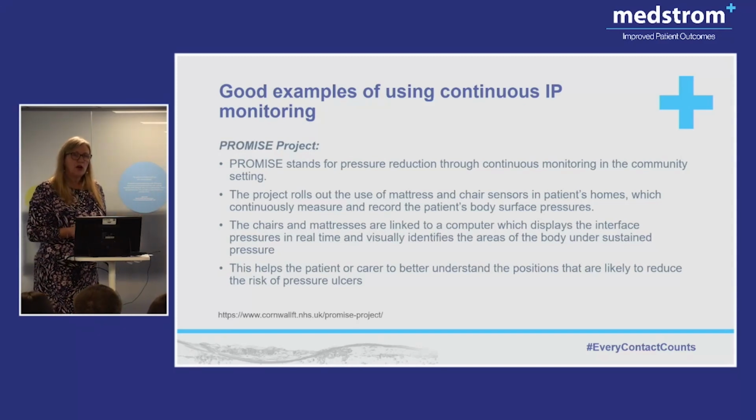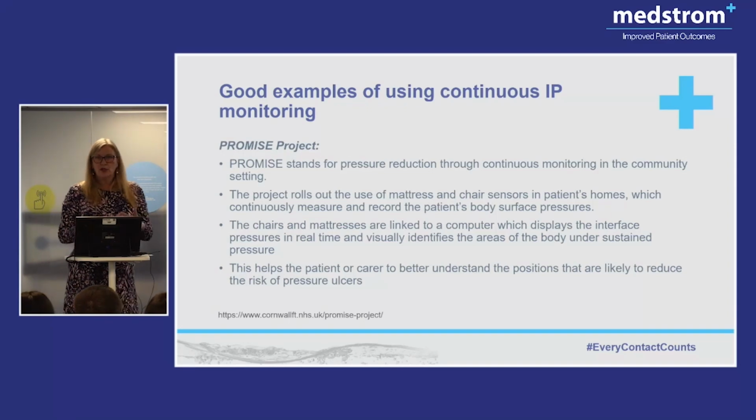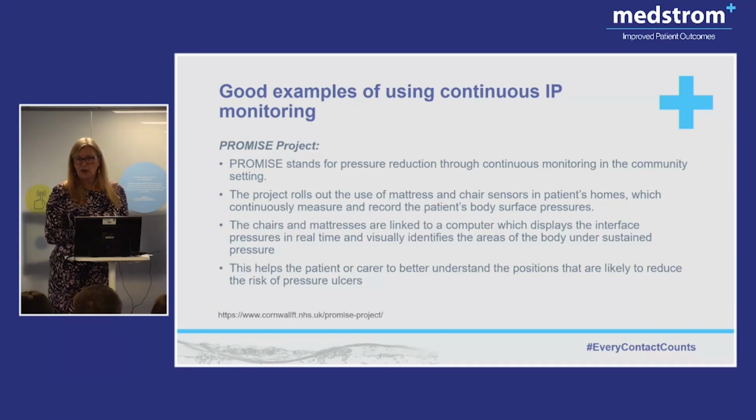So some of you may know Nikki Elwood-Wotton, who is a doctoral student from Southampton, working with Pete Worsley and his team down there. As a community TVN, she had lots of community nurses saying to her, we've got this patient and they're non-compliant with their mattress. And I use the word compliant, they're non-compliant with their mattress.